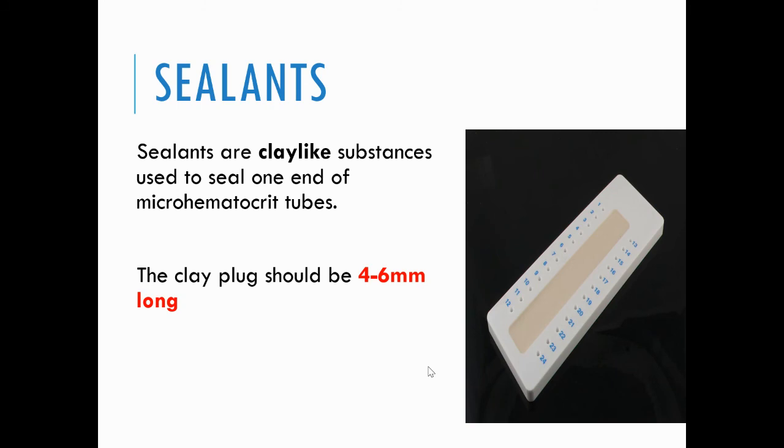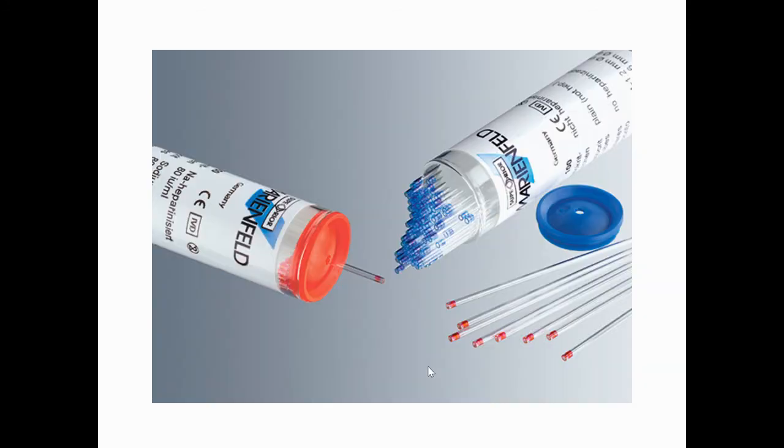Or the microhematocrit tubes, and the clay plug should be 4 to 6 mm long. So imo na siyang ipaturok dira ang imong capillary tube and makakuha na siya og clay. So these are examples of our microhematocrit tubes.